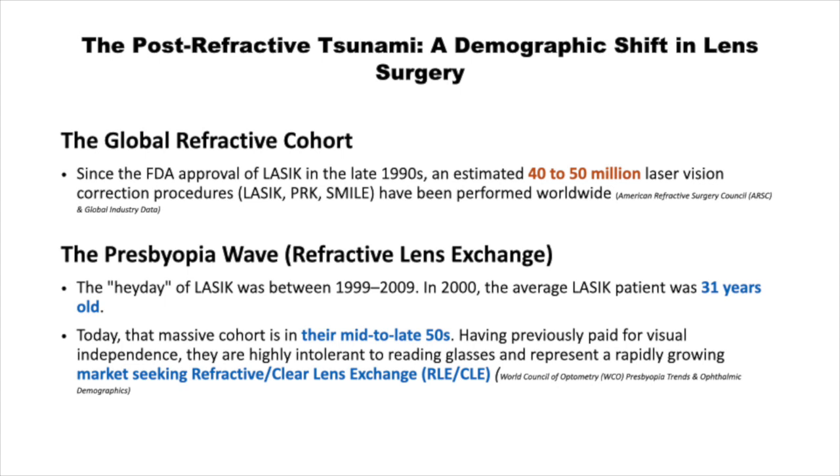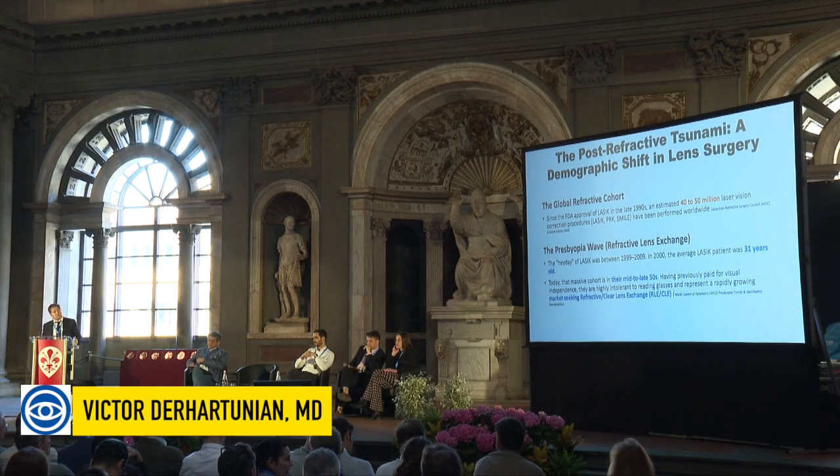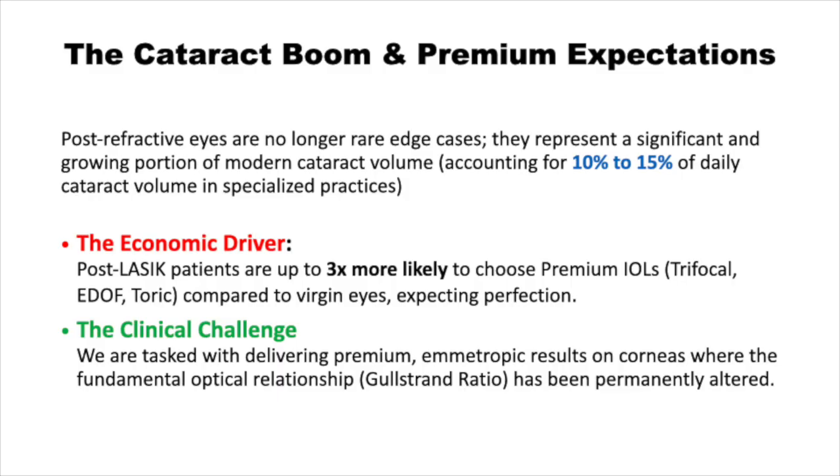So they are either presbyopic or they have a cataract, and they also need another solution. And the solution is either refractive lens exchange or cataract surgery. But here we face a problem of IOL calculation. And these people have been used to being glass-free, and I strongly believe that the wish continues, and they want to be glass-free in the future too.